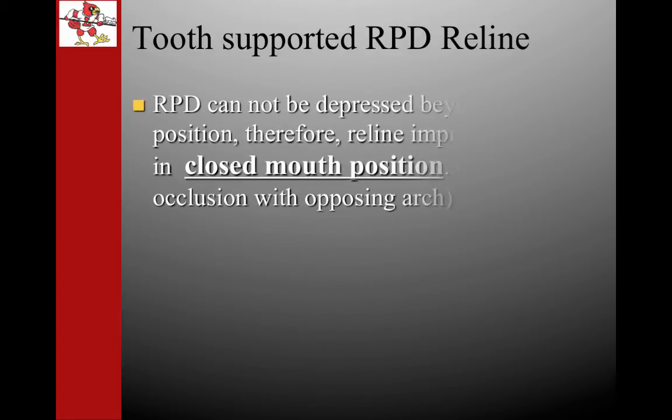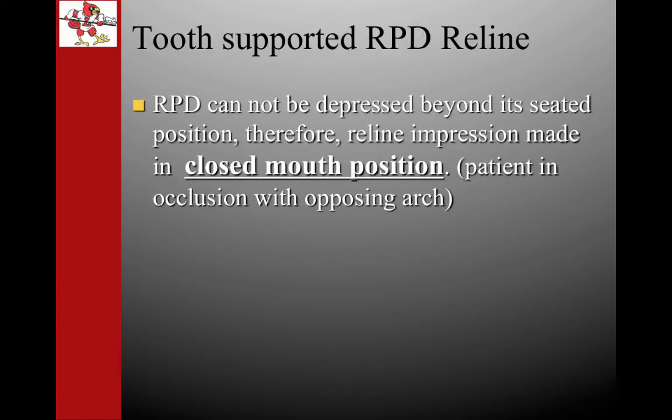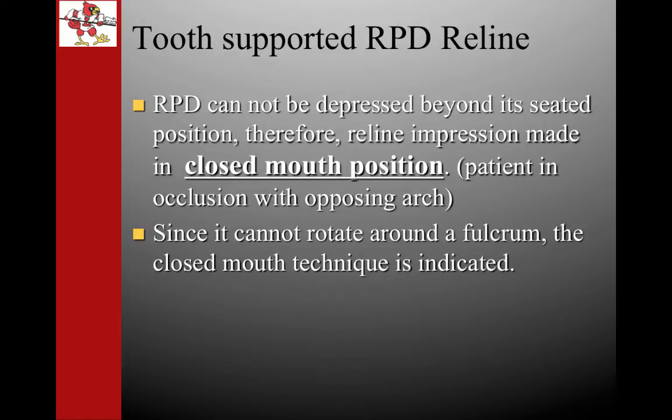The tooth-supported removable partial denture, as we have already said, cannot be depressed beyond its seated position because of the abutment teeth rest on each side of the edentulous area. So therefore, we can use a closed mouth position when taking a reline or a rebase impression. The other reason is because it cannot rotate around a fulcrum. The closed mouth technique is indicated in this type of situation. There's a clasp assembly at each end of that edentulous area, keeping it from rotating around any type of fulcrum line.